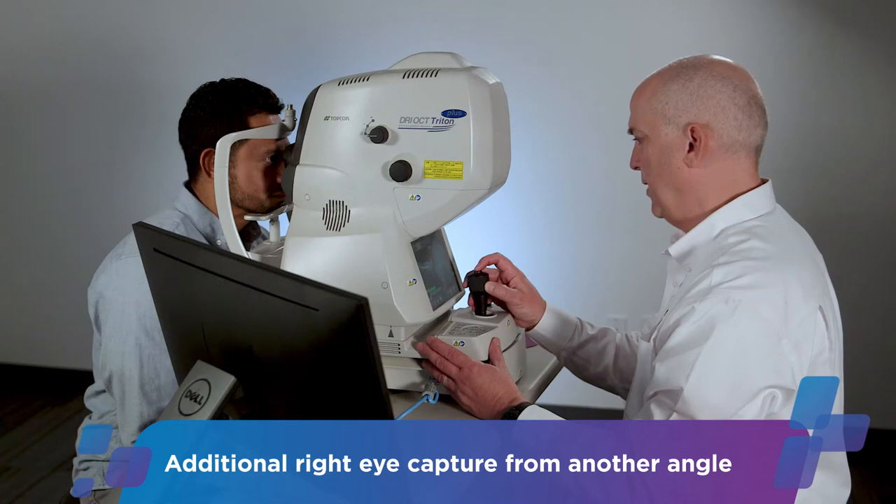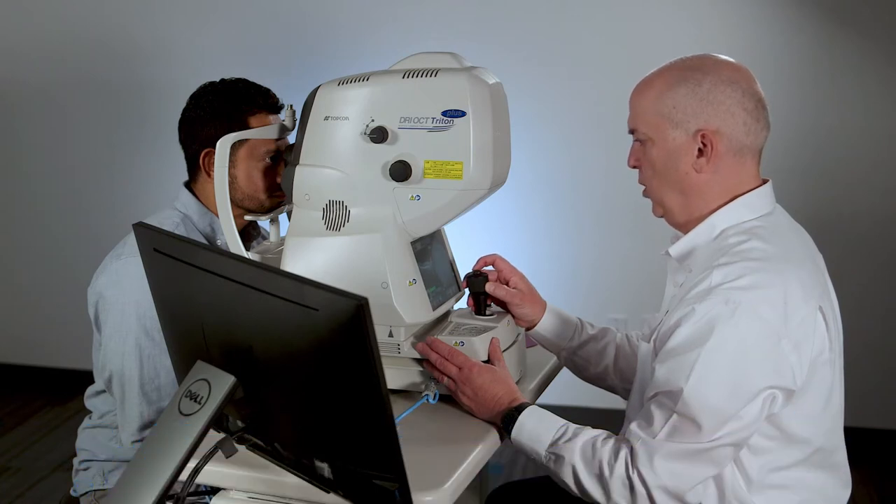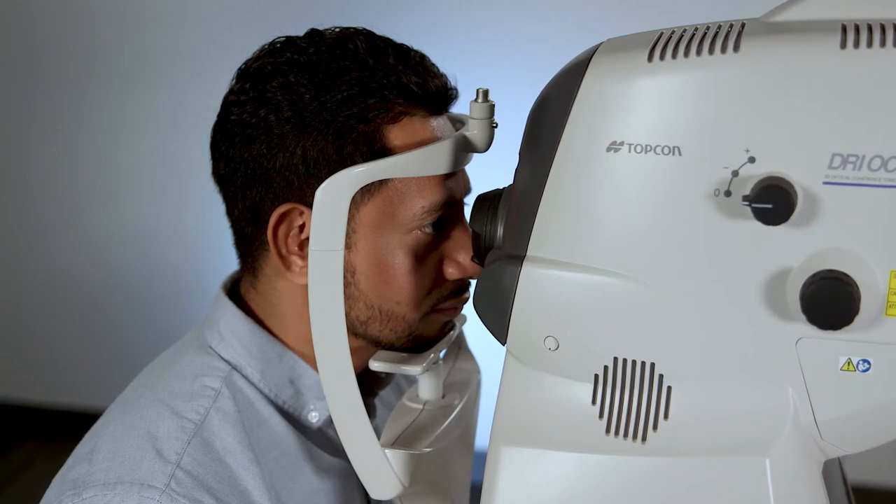Good. Now hold your blink for about three seconds — three, two, one. Hold it. Perfect.